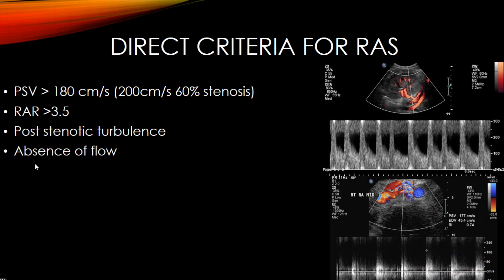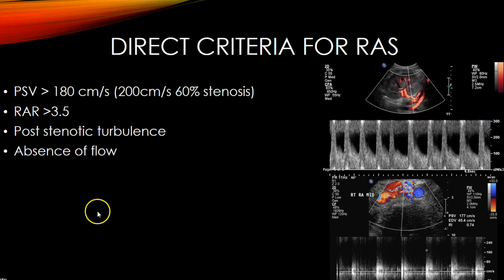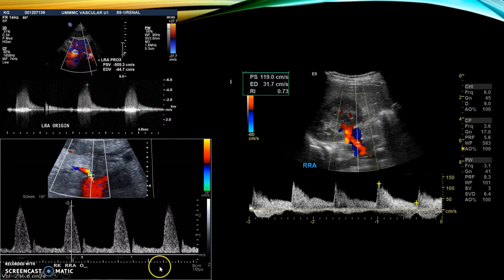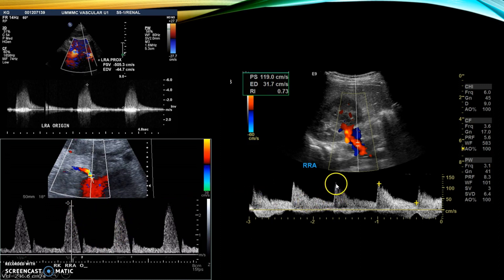Absence of flow is also a direct criterion — if you have a clear view of the renal artery with no flow and a very atrophic kidney, that's likely chronic obstruction. Examples of high peak systolic velocities include approximately 300, 505, and 246.6 centimeters per second, all with spectral broadening. A normal renal artery waveform shows a sharp, fast upstroke, a dicrotic notch, and abundant diastolic flow.